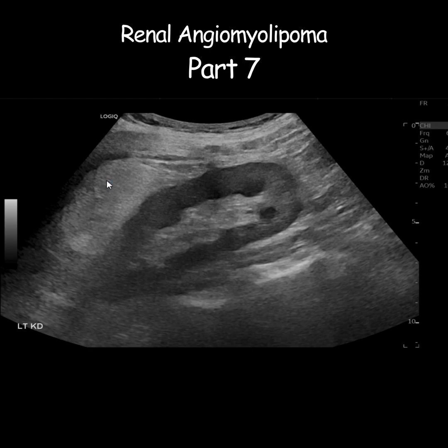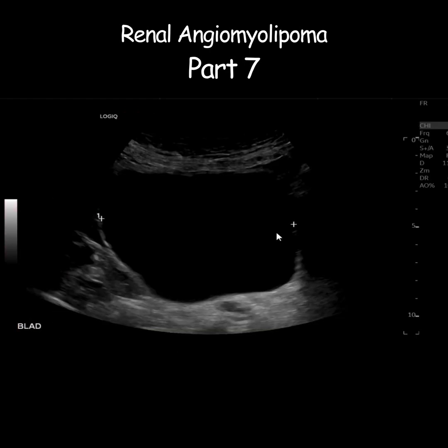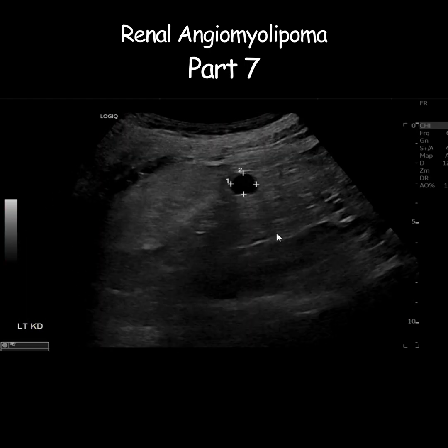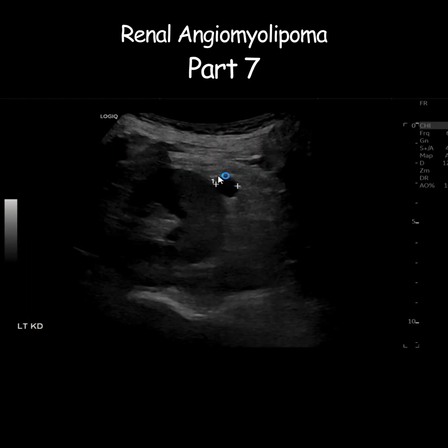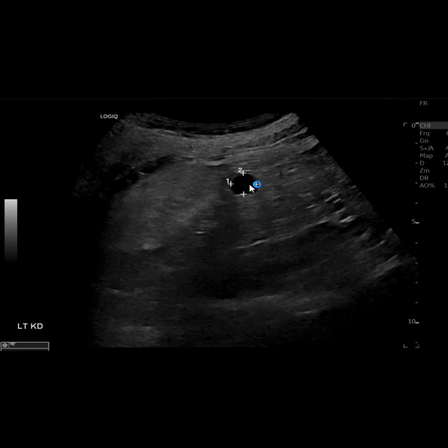Also, there is a simple renal cyst in the left renal cortex just below this angiomyolipoma.